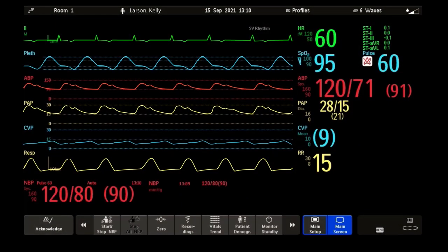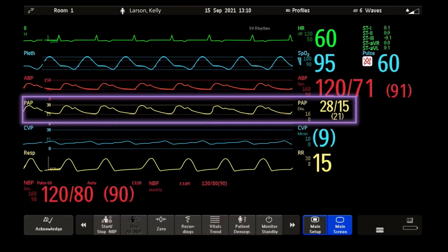Pulmonary artery wedge pressure is a procedure performed on the monitor and requires a pulmonary artery pressure line. Before you perform the wedge procedure, make sure the pulmonary artery pressure (PAP) label is set up by confirming that the PAP numeric and waveform appear on screen.